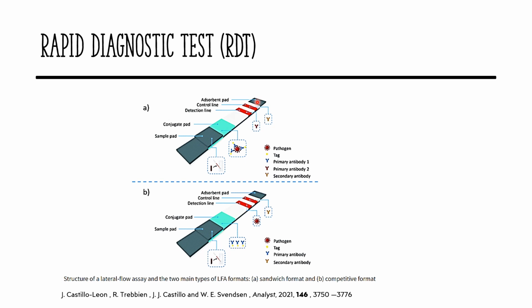When the liquid sample passes through the conjugation pad, it rehydrates the labeled antibodies, which attach to the antigen epitopes. The labeled antibodies attached to the antigen continue traveling along the LFA membrane and reach the detection and control lines. If the antigen of interest is present, a colored line will appear at the detection line. The color intensity at the test line is directly proportional to the analyte amount present in the sample.